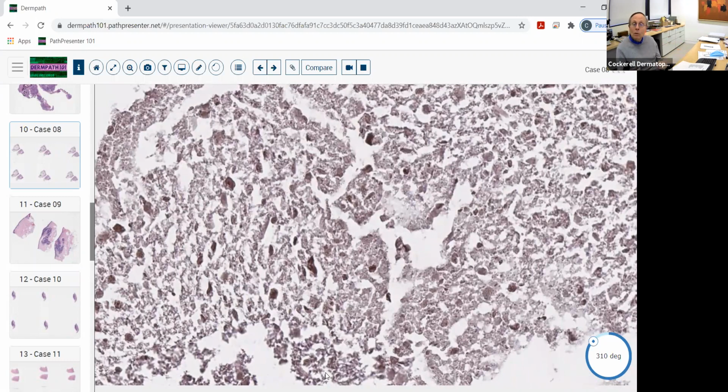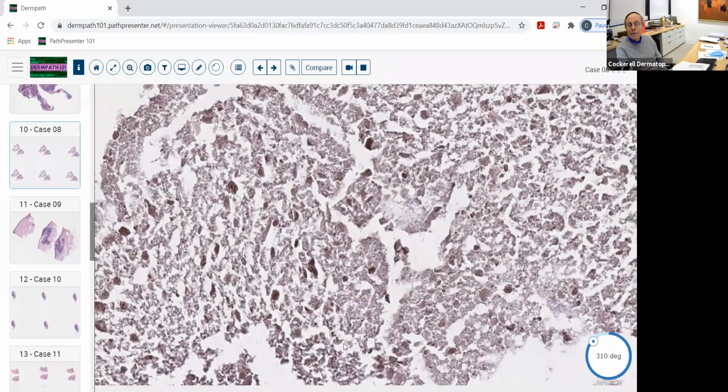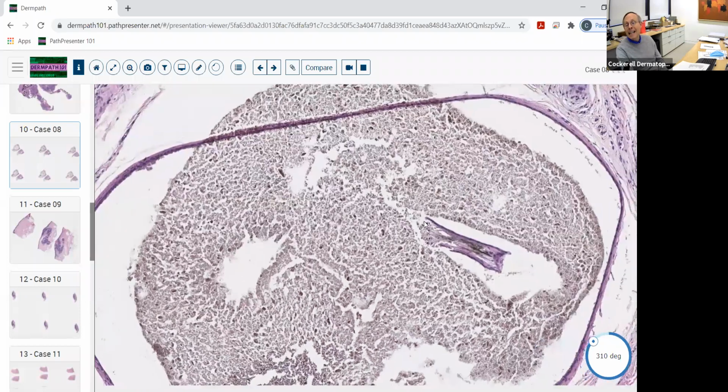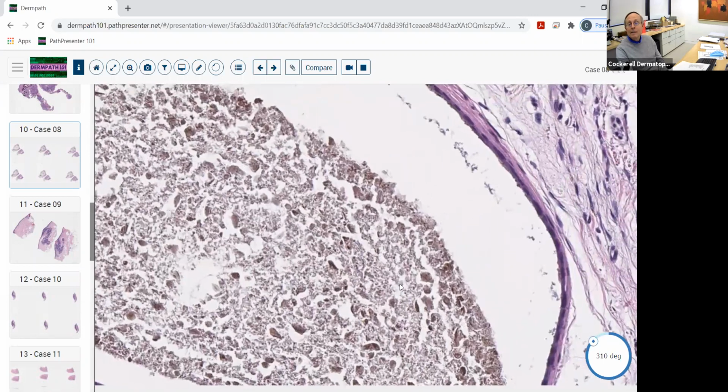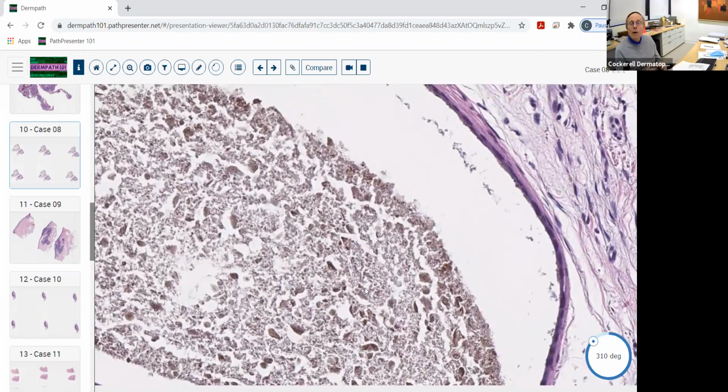Well, they almost look a bluish gray color, and they very commonly get biopsied and submitted as rule-out basal cell because of that. Now, this is kind of unusual. The vast majority of them do not have this dark discoloration in here. Some of this may be lipofuscin pigment as opposed to melanin, but in some cases it actually is melanin. But it's totally benign, doesn't mean anything serious, but these things can simulate melanocytic lesions clinically sometimes. They can simulate basal cell carcinomas.